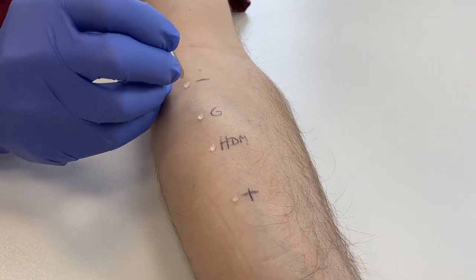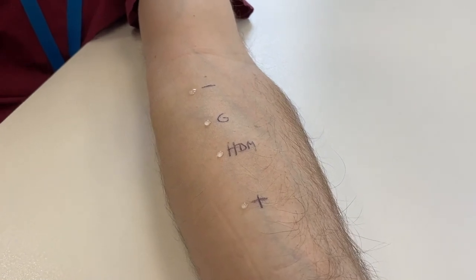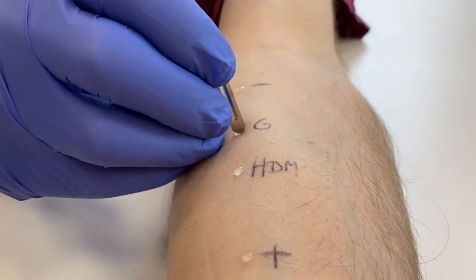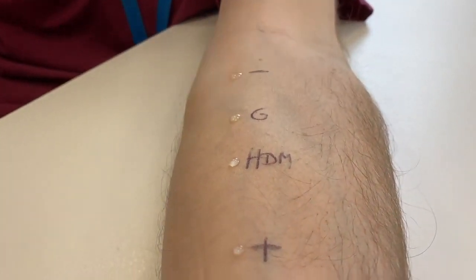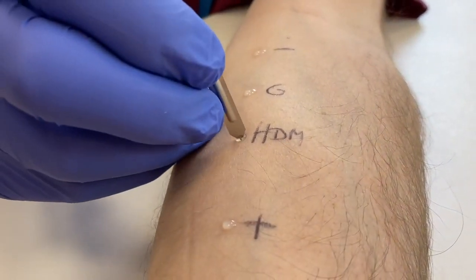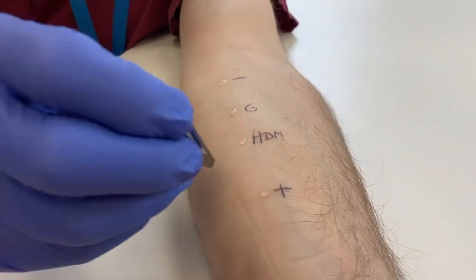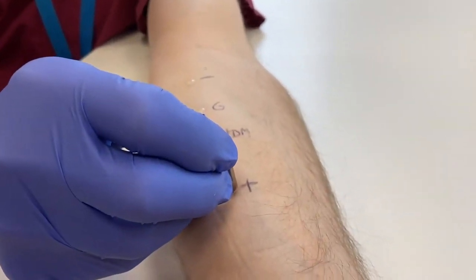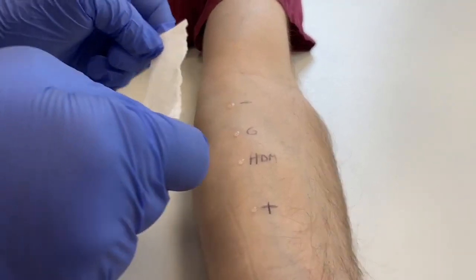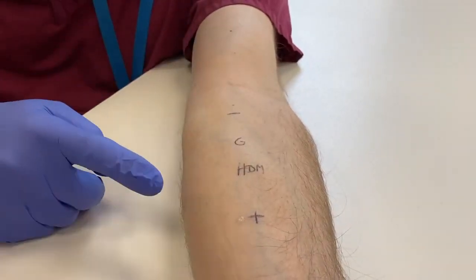Once the allergens are all applied to the skin surface and with the patient holding their arm still, the skin is pricked gently with the lancet held vertically through the centre of each droplet of allergen or control. Each control or allergen requires a new lancet so the allergens are not mixed. It's important that you apply the same pressure each time, because if you press harder you get a stronger wheal. The key thing is to perform the skin prick test in exactly the same way for each allergen. The strip of tissue is used to dab off the residual allergen — dab and do not wipe, as otherwise there is a risk of cross-contamination.